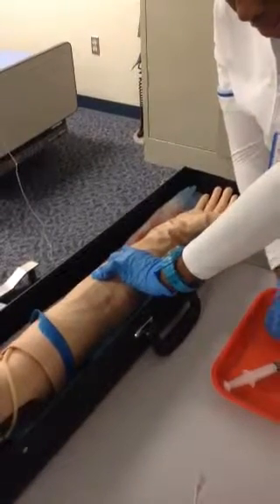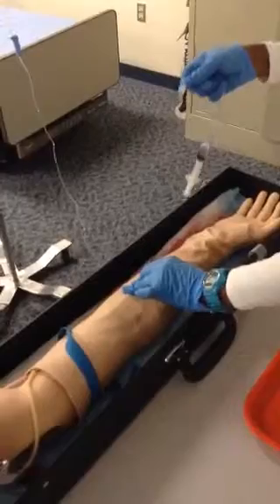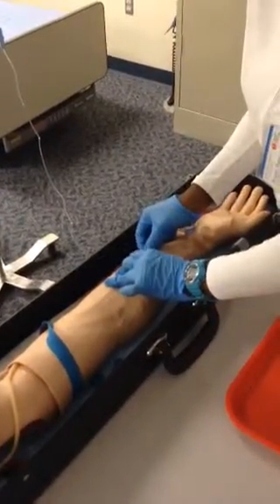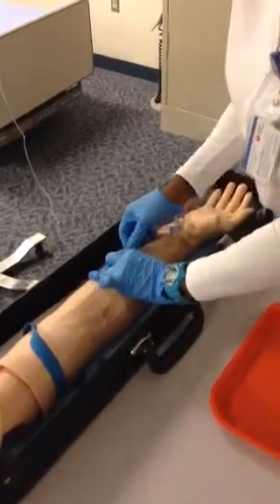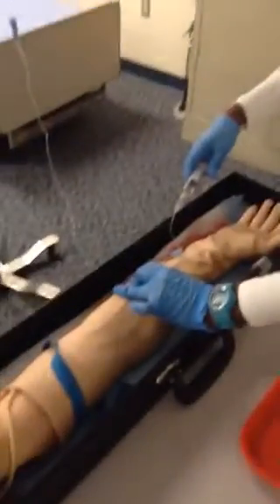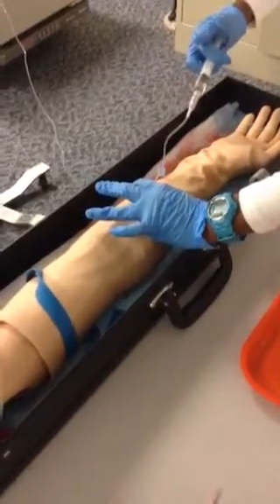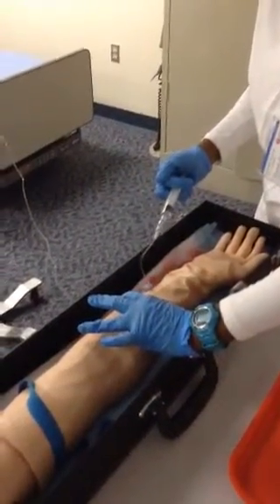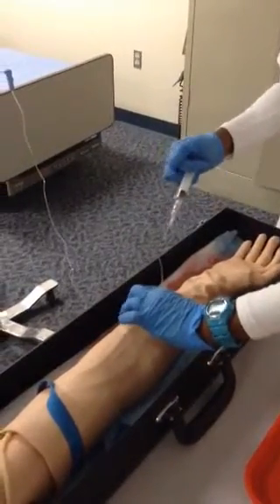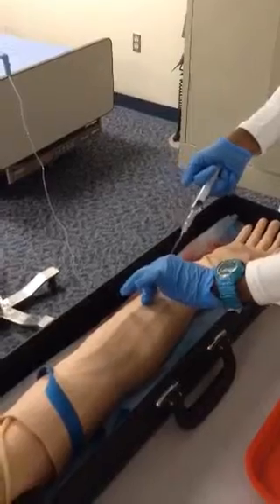I'll then grab the clamp and my tubing to connect, keeping this field sterile. I'm going to unclamp this and aspirate. I'm going to let go of the vein right here, keeping this stabilized. I'm going to aspirate and I get flashback. Then at a stop-and-go flow, I'm going to flush it, preventing any backflow. On the last couple of milliliters, I'm going to clamp the line simultaneously.